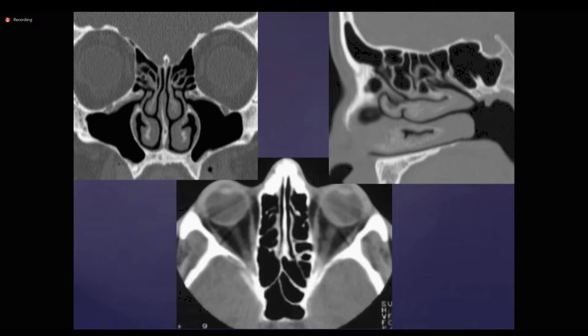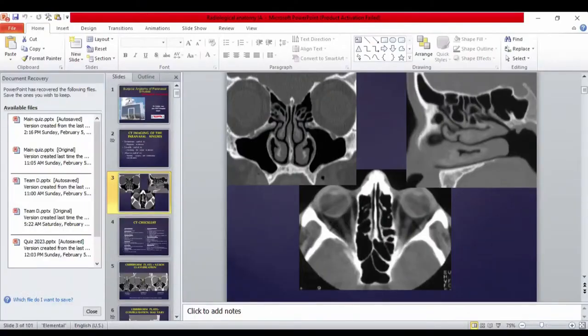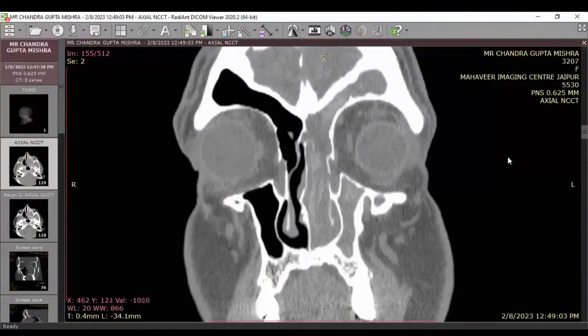And in order to do that, you need to have a good three-dimensional dynamic imaging, because certain structures are best seen in certain cuts. Axial, coronal, sagittal together give complete information. And to this, the dynamic information helps you relating each other in all planes. It's not about getting CT scan done simply. It's about fine sections, multiplanar CT scan done, and then you can run on your software to see dynamically everything.